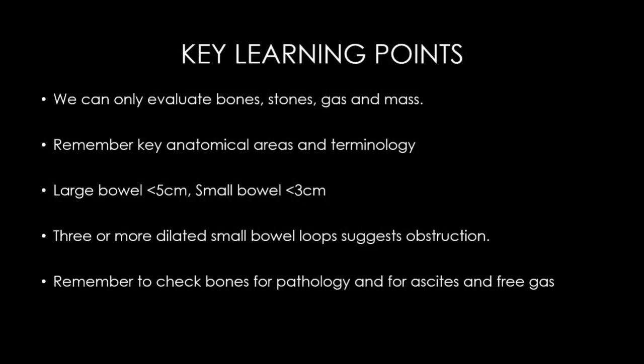Okay, so a bit of a whistle-stop tour there, only short, but as I've said, we'll talk about specific abdomen pathologies later. I guess the key things to take away for your CPD and reflection on this will be abdomen x-rays are very limited, guys, okay? So do look at your referral criteria depending on what country you're in.